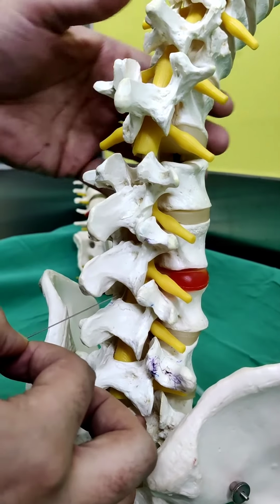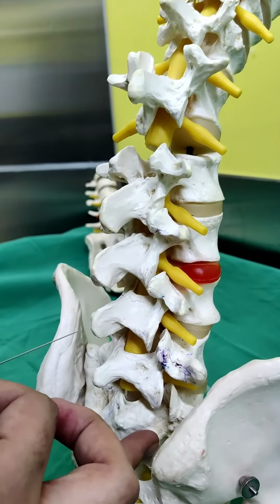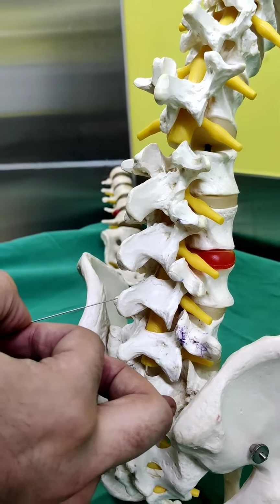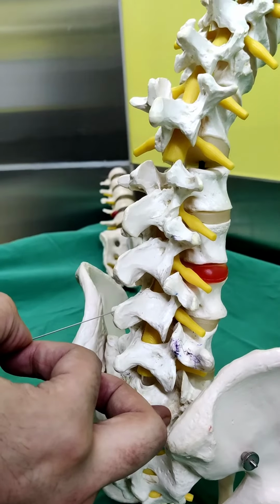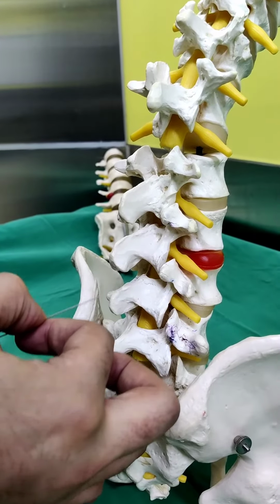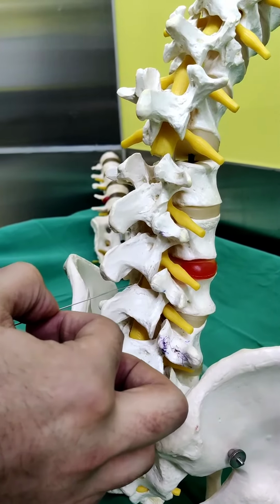Now some of the problems which we can face: as soon as we insert our needle, we hit the spine. That means we are too far and we are hitting the spinous process. So how we can overcome this is just reinsert the needle and take a proper prick above that.